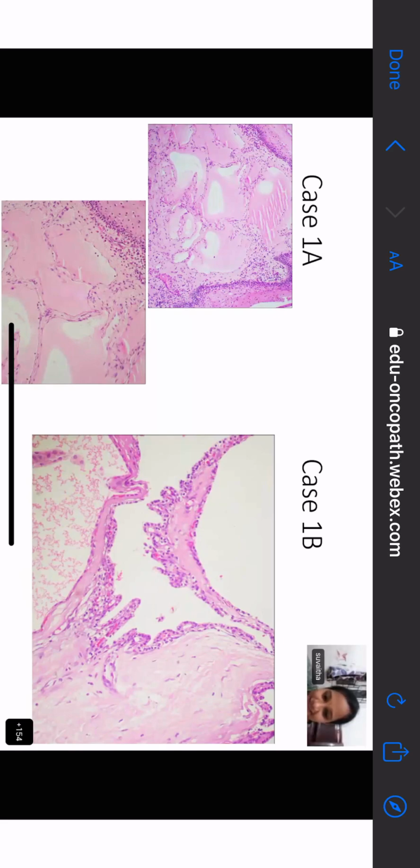You're not sure, but you said it was an epithelium. Despite the fact that they said it was an endothelium, you persisted in calling it an epithelium. So now tell me, you must have some very deep-seated reason for wanting to call it that. In the meantime, Bonita, is anybody in the chat box, please ask them to answer, or I'm asking them and they can answer. What do they think that case 1A the cysts are lined by? Epithelium or endothelium?